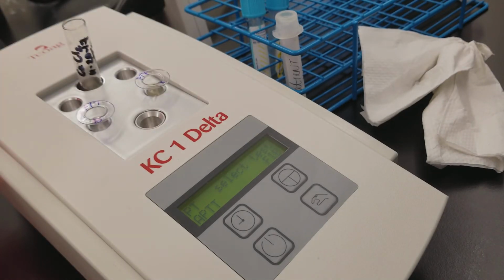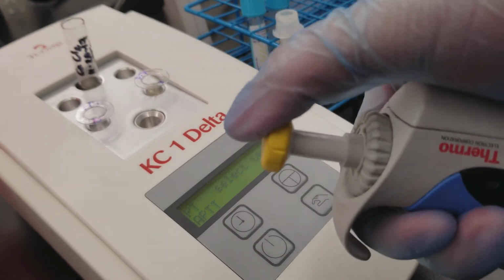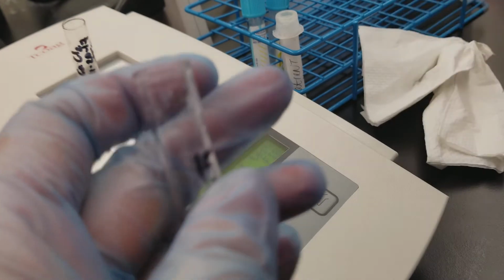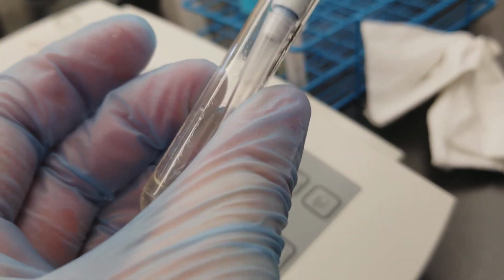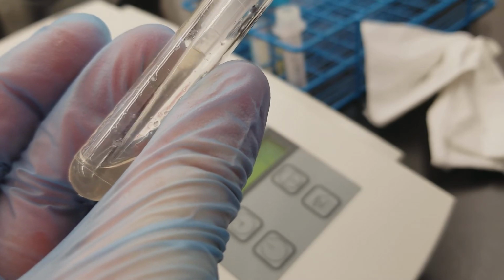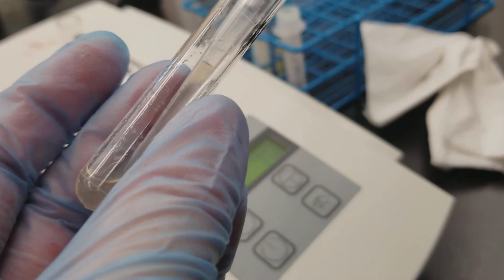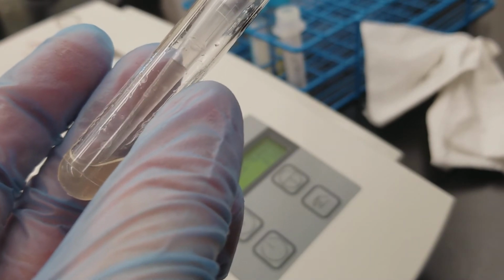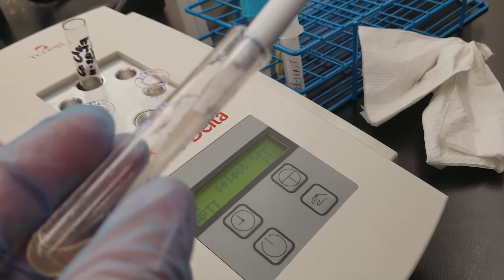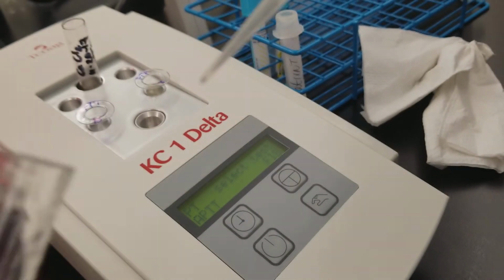Okay, now I'm going to do patient 15. Put another tip on there, a new tip. You never use the same one. Okay. Press down. Open this up. Put it down in there. Okay. So you never want to pull out while you're depressing your pipette. Okay. Because if you do, you'll get bubbles in there. And that won't work out for you. Okay, you'll have inaccurate results because it won't be the right amount of specimen.